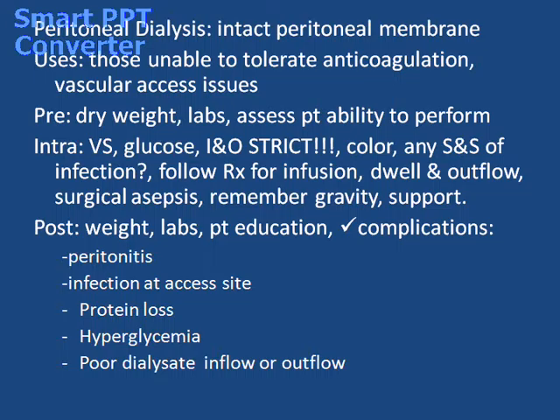We're going to look for signs and symptoms of infection, which would be fever, and bloody, cloudy, or frothy dialysate return. If it has a murky look to it, or a brownish look, the effluent, as it's called, is discolored, we're concerned about peritonitis. We're going to look for any signs of respiratory distress, abdominal pain, if we're not getting enough outflow, and if it is discolored.